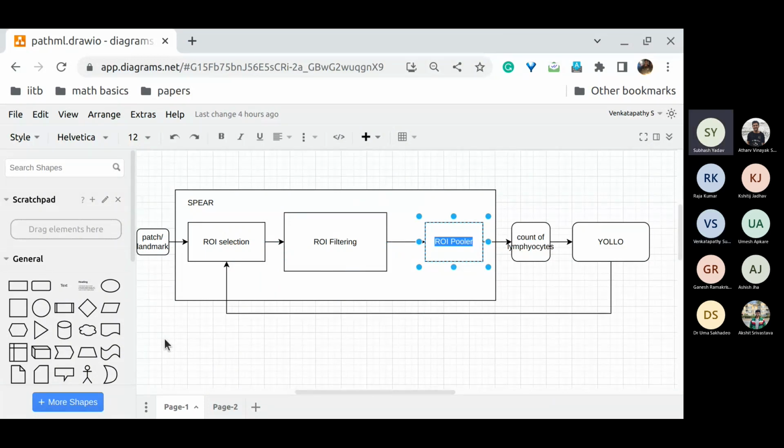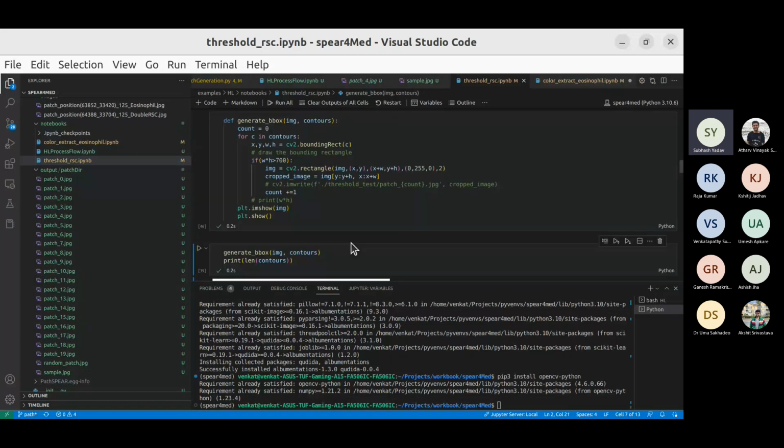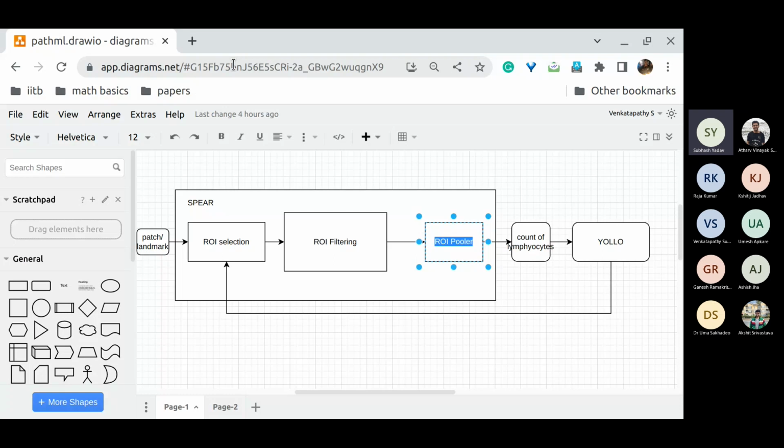I have some queries for Raja. This program, which labeling function was developed on what set? Is it some available open database, or was it developed on the TMS data which I had given you? Lymphocytes can be of various types, and there are other cells like plasma cells.